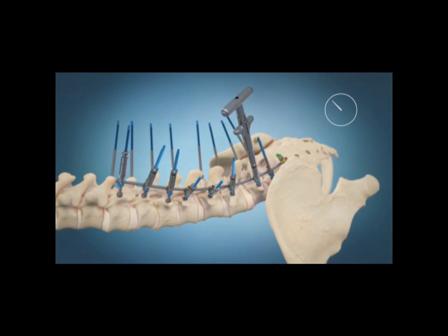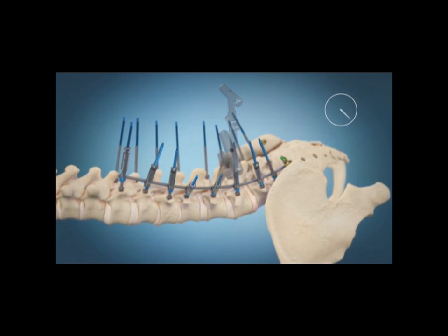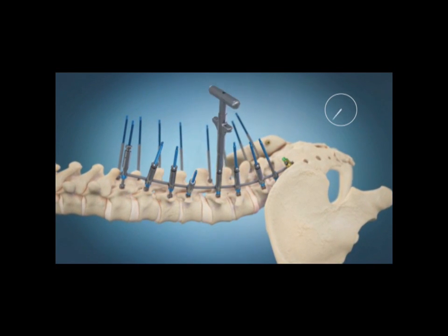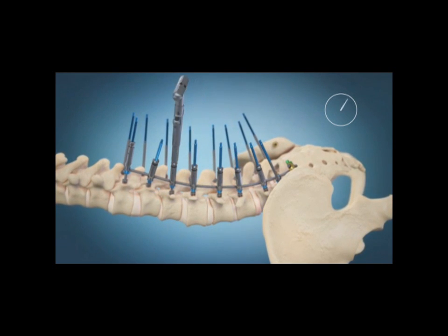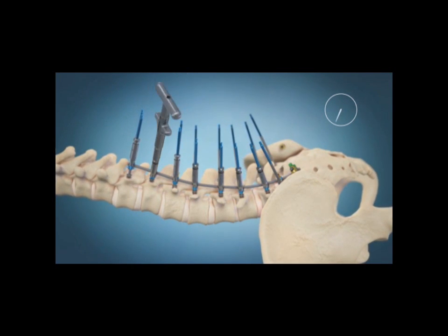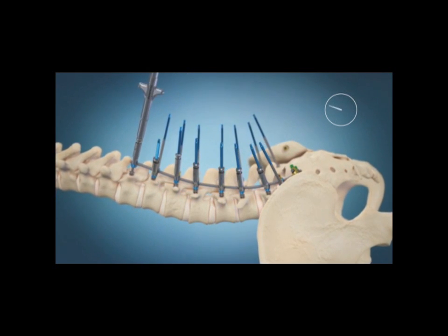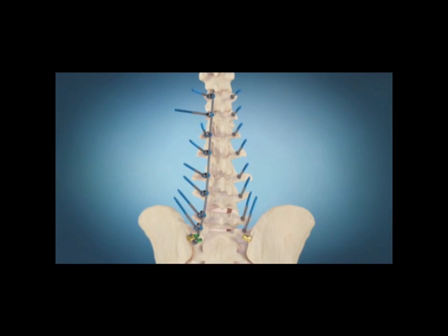You go back and just incrementally, gradually, one at a time, slowly tighten each of those connectors, pulling the spine over a little bit at a time, over time, spreading the stress of the correction over multiple points of fixation. Once the first rod is placed, then attention can be turned to the second rod.